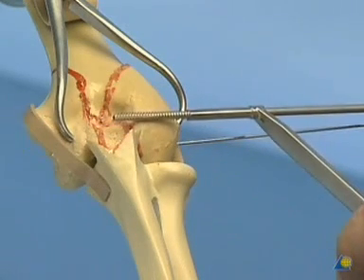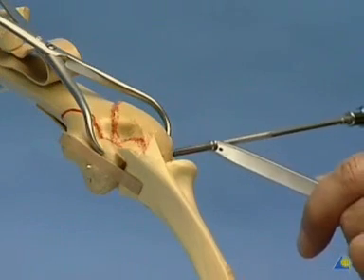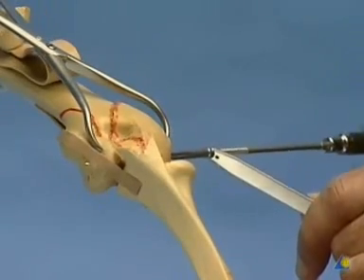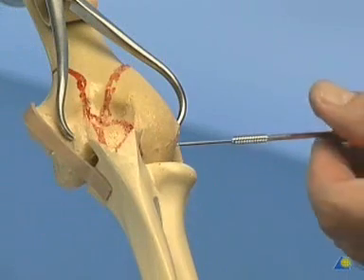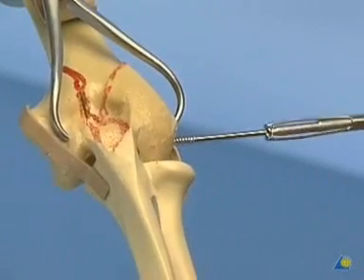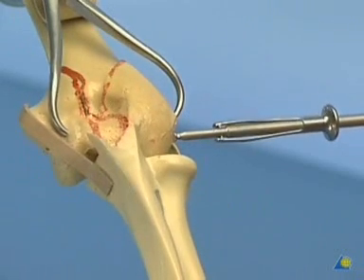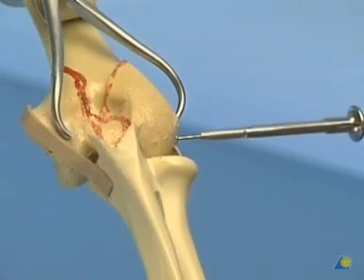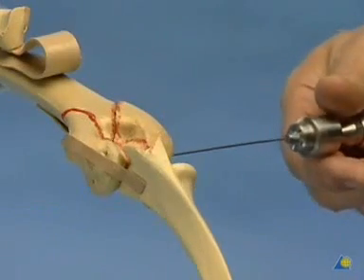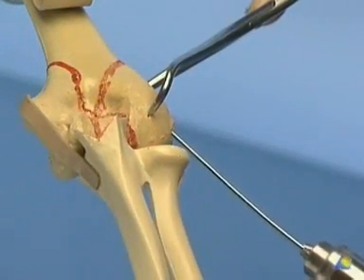The cannulated tap is used only to give the screw a good start in hard cancellous bone. Insertion of the 3.5 mm cancellous screw. Tightening the screw induces interfragmentary compression, securing the articular fragments to make them one block. Clamps and K-wire are removed. This block is now reduced to the shaft of the humerus. K-wires and pointed reduction clamps may be used to hold this second step.